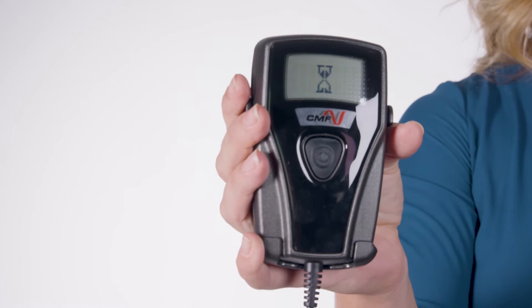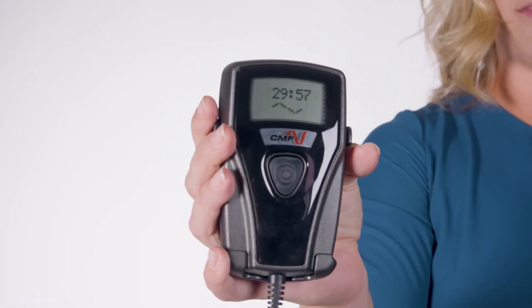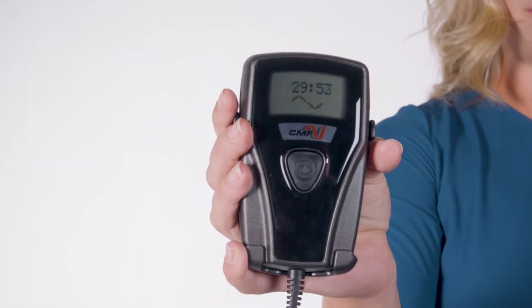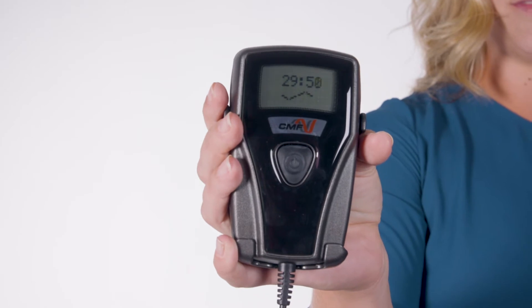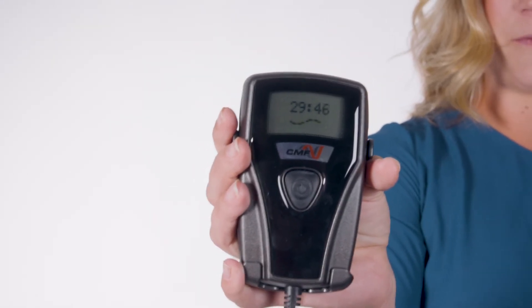A record of your treatment will be displayed until it beeps. The 30-minute treatment countdown will begin as shown here. When using the device, the LCD screen will continue to show the time remaining on your daily treatment. You should complete your entire 30-minute treatment in one session.